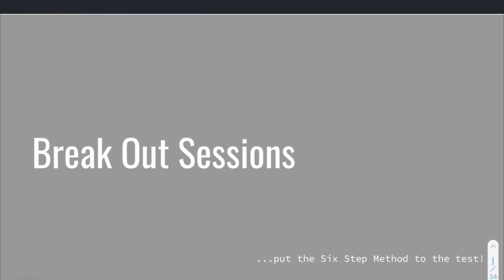So that's just a little bit of practice on how to utilize these moving forward. We are going to break you out into breakout sessions where we will get you practicing your ECG technique, your 6-step method, and determining some ECGs. So good luck.